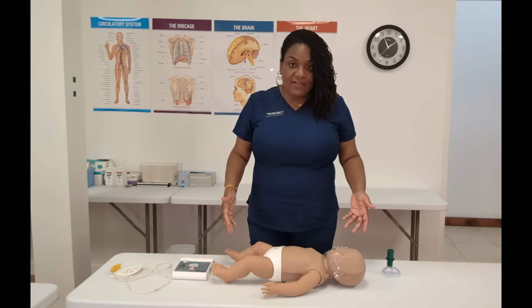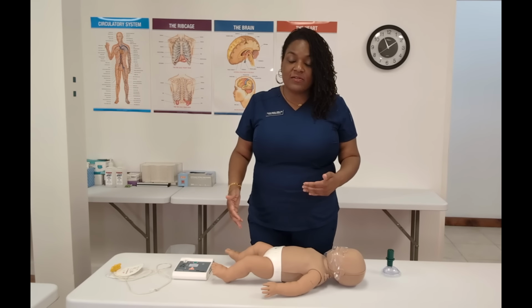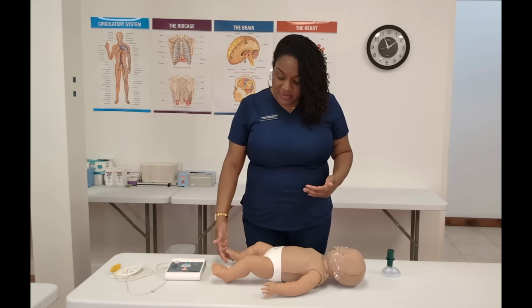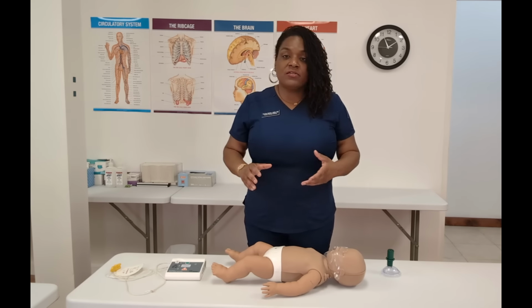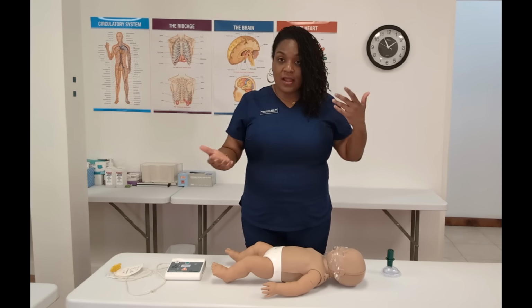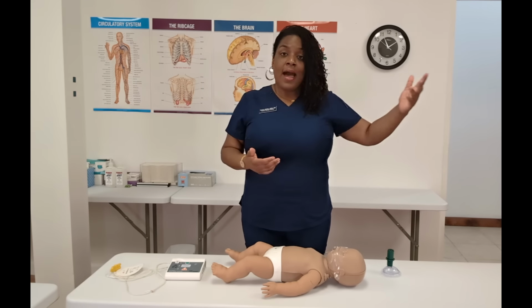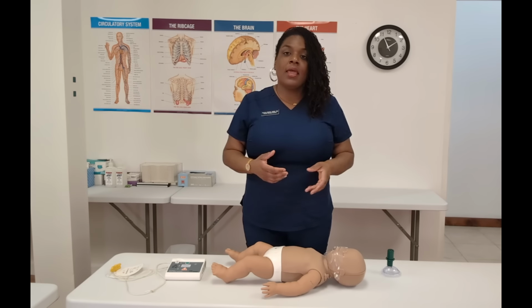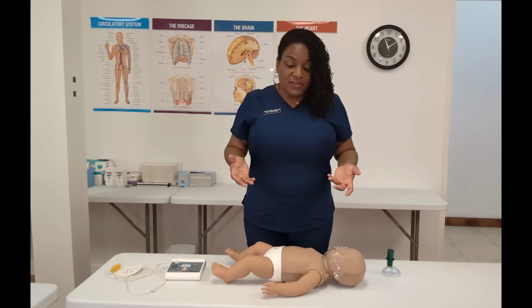And now that we have an infant here, the way that I check for responsiveness is I actually tap on their foot, which is their more sensitive area. So I'm going to tap on this baby's foot. There is no response. I'm going to go ahead and call 911 from my cell phone. If there is a person nearby who can help me, I can point to them and say, hey, you call 911 and come back. And 911 is going to say, what's the emergency?